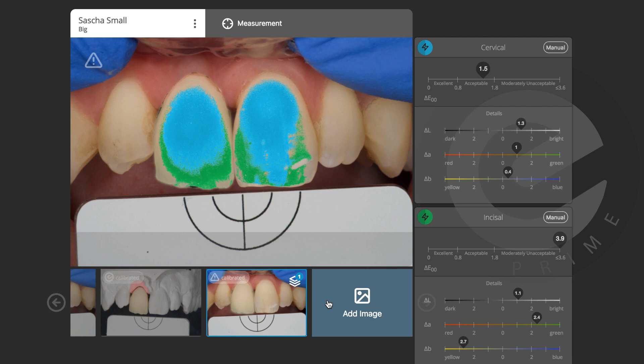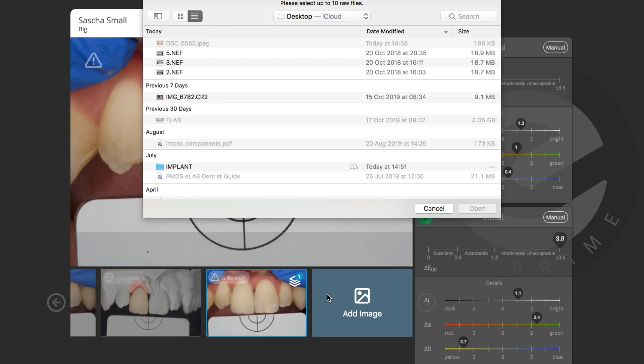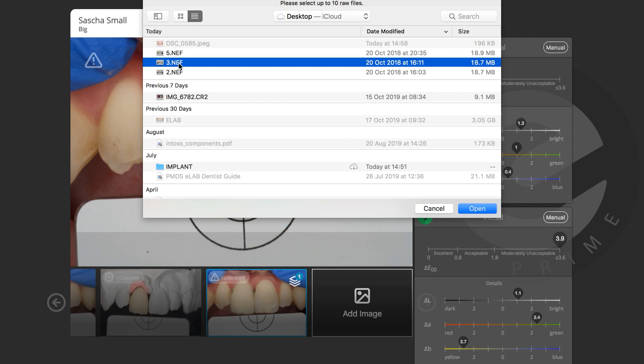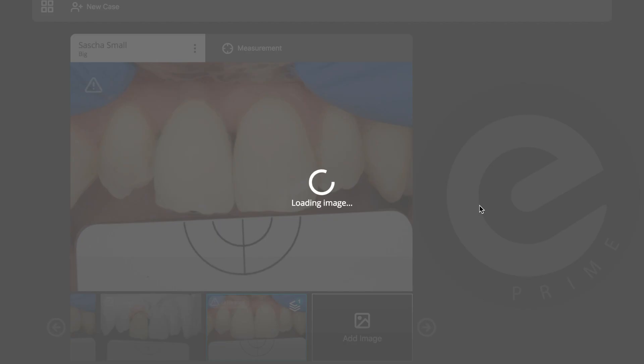I know what I need to do, so I'll add another image — image number three. I'll take my brush, apply red stain and blue stain, and adjust the crown accordingly. I'll stain it just a little bit, take a picture of it, and see how it looks. This is picture number three.